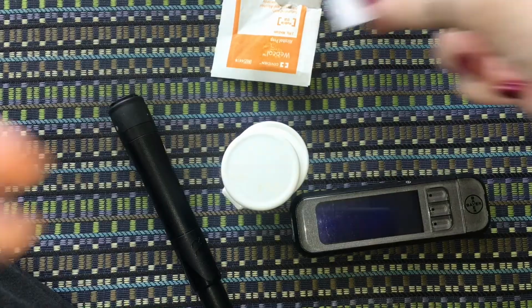In this next part, I'm going to be actually taking my blood sugar and showing you guys. This is not a gory process, however, it does involve some blood. So if you're extremely squeamish to blood, maybe don't watch this next part. It's just a finger poke and it is hardly any blood at all, but I don't want to just do it and then you realize, and if you're not good with blood, just skip past it. It's fine.